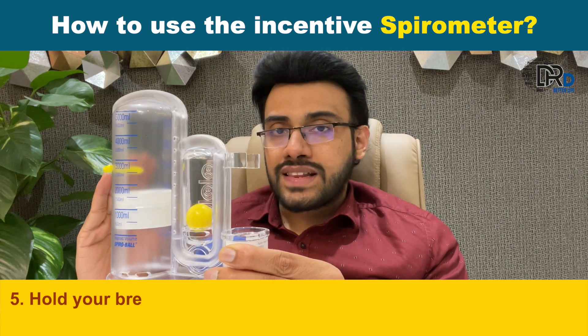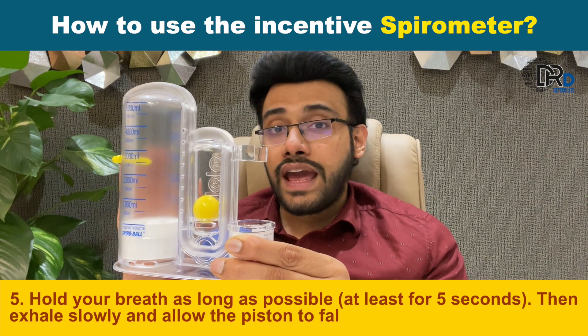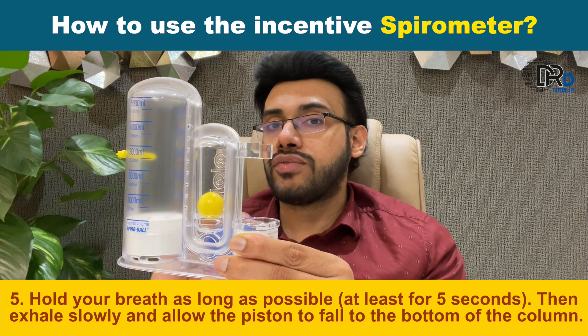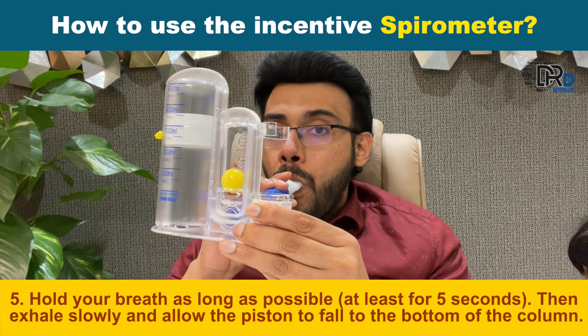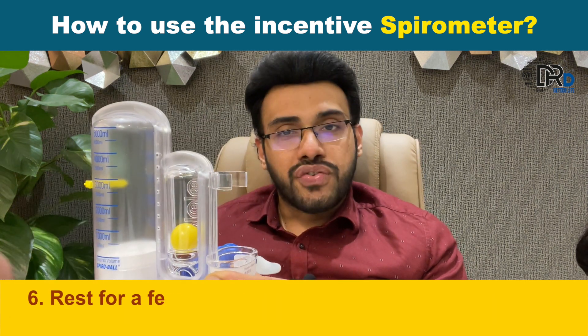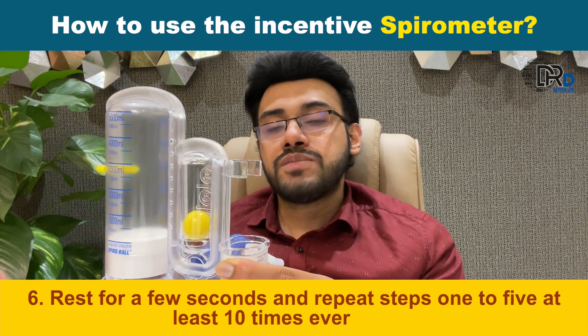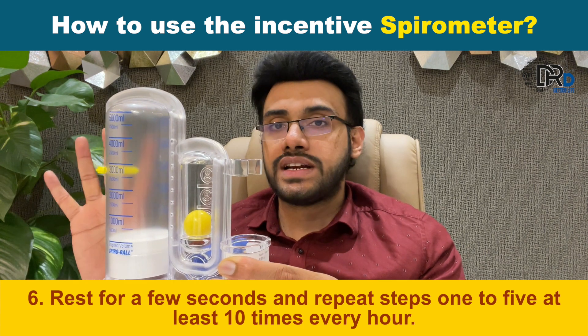Hold your breath as long as possible, at least for five seconds. Then exhale slowly and allow the piston to fall to the bottom of the column. Then rest for a few seconds and repeat steps one to five at least ten times in a set. This we have to repeat four times in a day.